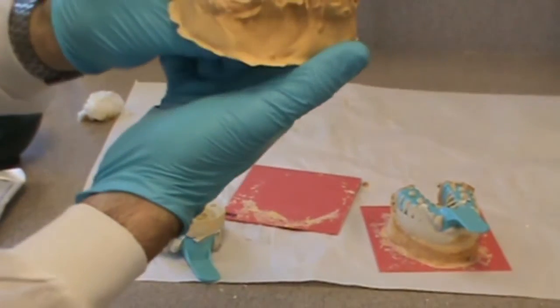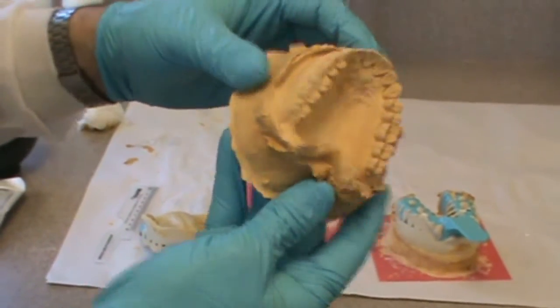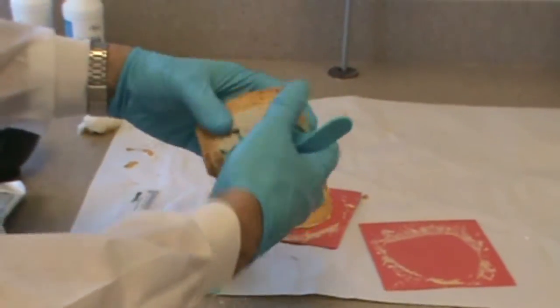There's no major voids in our base. It's completely in contact with the first pour-up. The same thing with the lower.